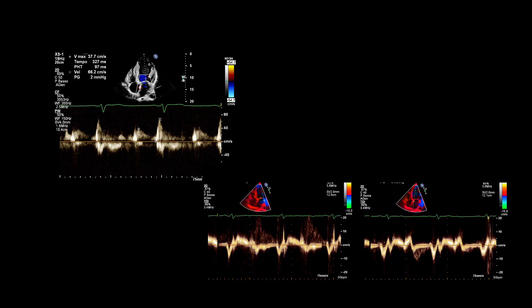Other frequent characteristics are right ventricle dysfunction, atrial dilation, functional mitral and tricuspid regurgitation, and secondary pulmonary hypertension.